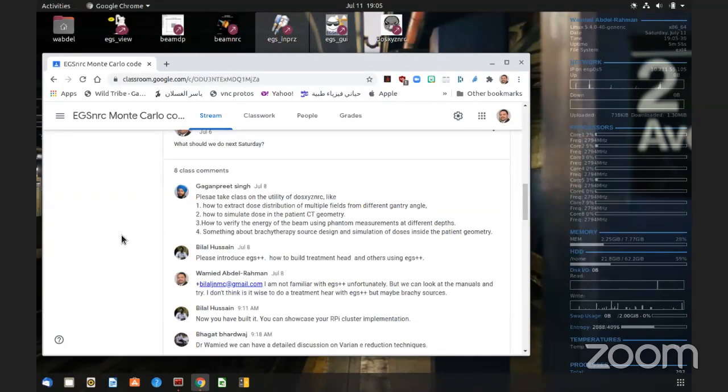Now, when you want to add this dose distribution to another dose distribution, it's doable. You can do this, I think, through stat dose. But the problem is if you have different weights, different MUs, which is what we usually do in radiotherapy, then how do you weigh these distributions? I don't know. Maybe there is a feature. I haven't done it. I know with MMCTP, it does it for you. So Andrew could have coded it somehow, or it's something in stat dose. You can actually give different weights.